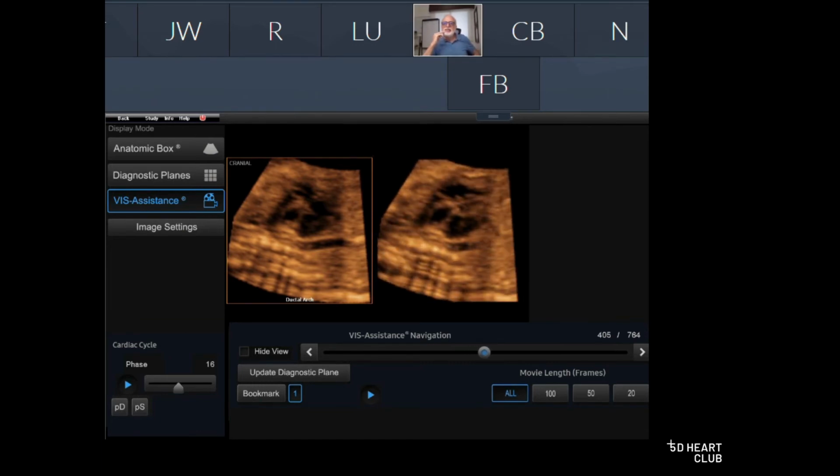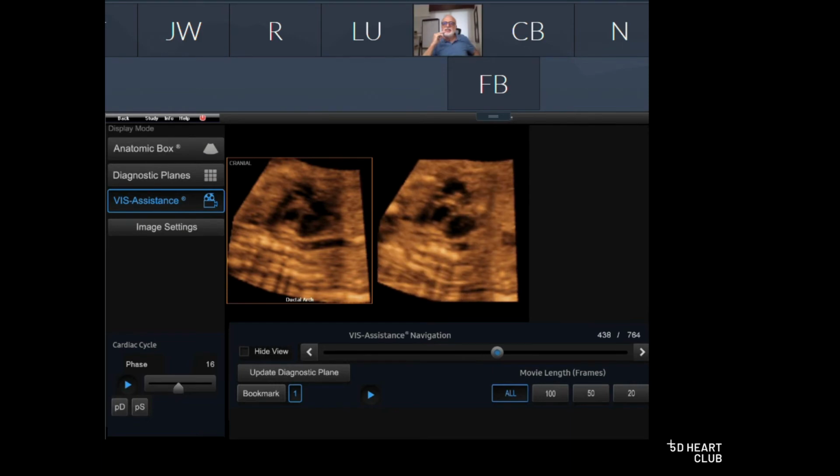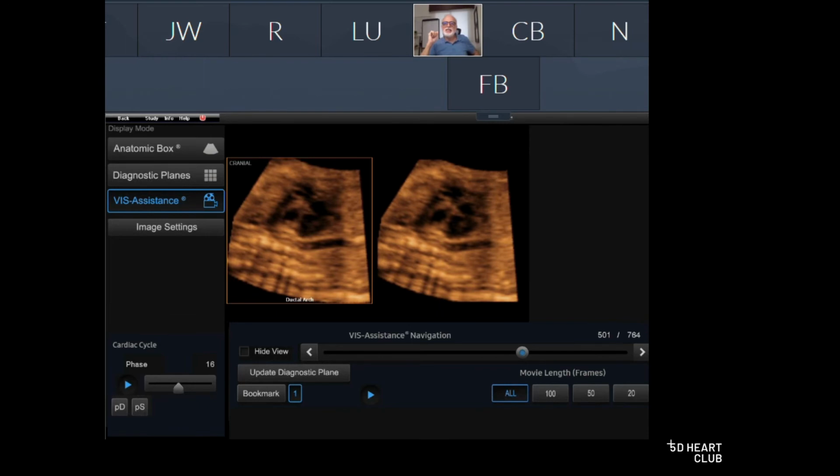Keep going. Keep going. Very good. It's coming. Okay, stop. No. Yeah, beautiful. Bookmark.